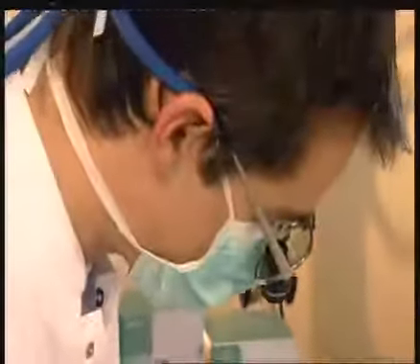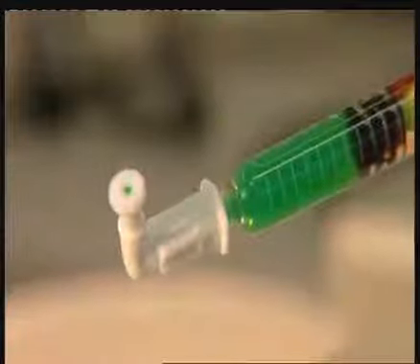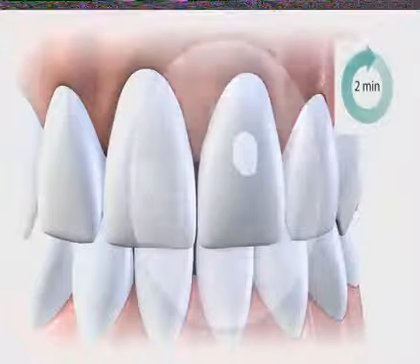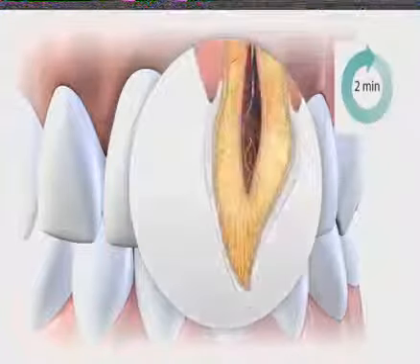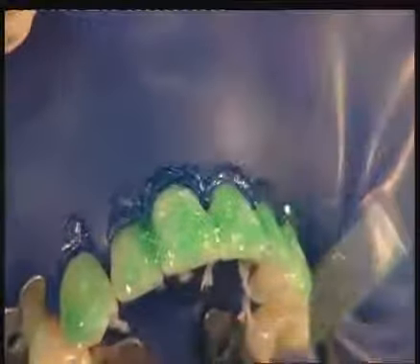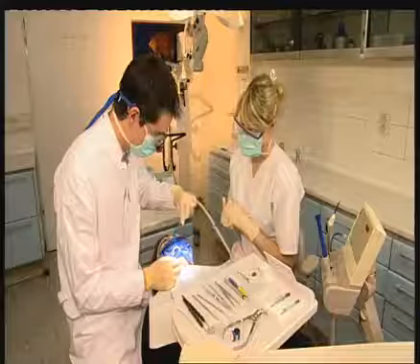In the first steps, the affected hard tissue is prepared for the actual infiltration with a special HCL gel, which is applied to the affected area with one of the specially provided tips. A contact time of two minutes for the gel must be observed. The use of HCL gel ensures the successful removal of the surface zone of an early caries, which helps facilitate the infiltration process. After the activation time of two minutes, the pore volume of the incipient caries is accessible. An incomplete removal of the surface zone will disturb the infiltration process.